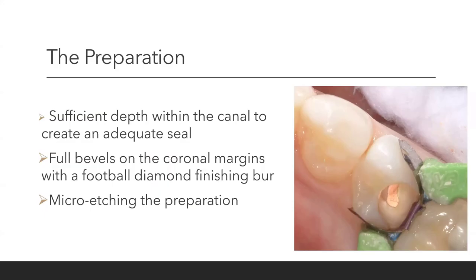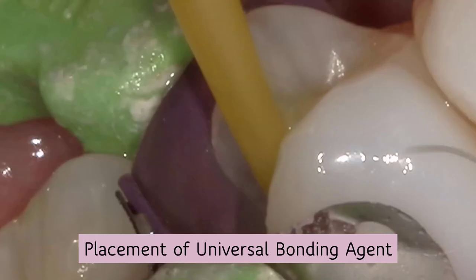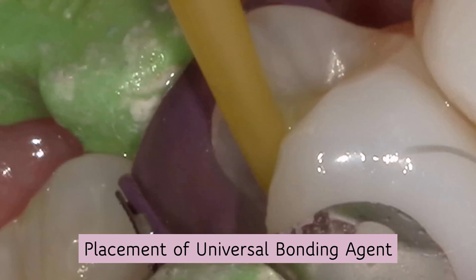For the preparation, I want to go into the canal and make sure I've removed enough gutta percha to create an adequate seal. I want to bevel all my coronal margins, usually with a football finishing burr — yellow or red. Every endodontically treated tooth should be micro-etched. Why? You've got cement and gutta percha debris in there. So after you're done prepping, you're going to micro-etch the entire preparation. Then a 15-second total etch, followed by placing your universal bonding agent. Universal bonding agents bond to everything — zirconia, eMax, old composite, metal.